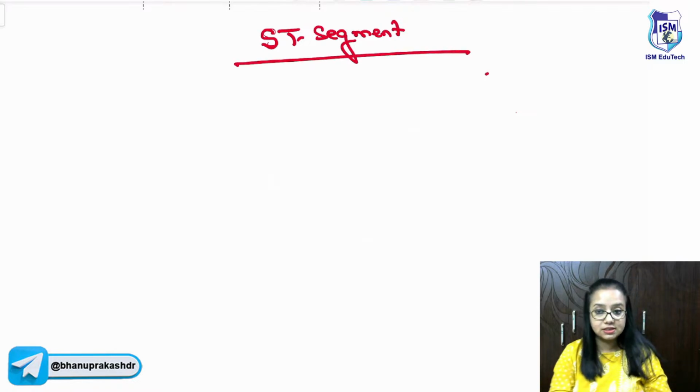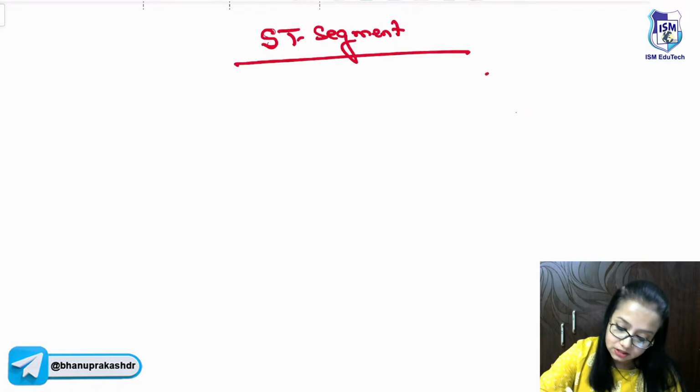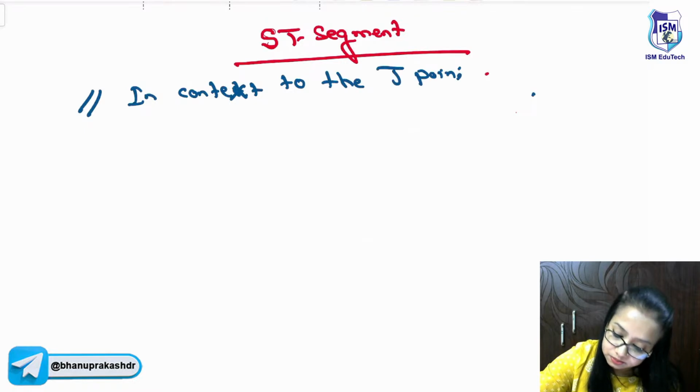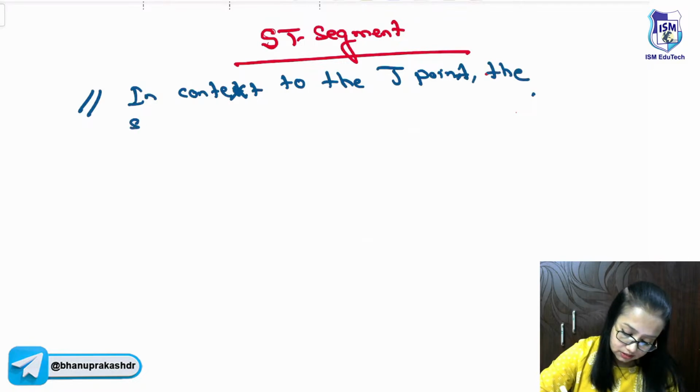Now, what is the ST segment? The ST segment is in context to the J point, the segment.